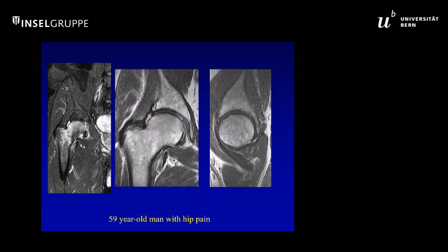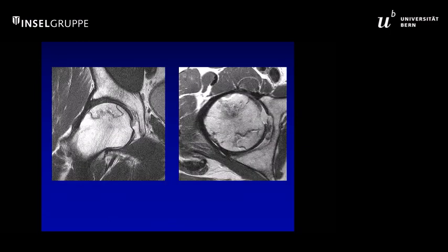Be careful about the subchondral insufficiency fracture, characteristically lots of bone marrow edema pattern on one side of the hip with that obnoxiously subtle low signal intensity focus we can see here. And this is, of course, distinctive from AVN, which is the classic appearance of AVN, not the subchondral fracture.